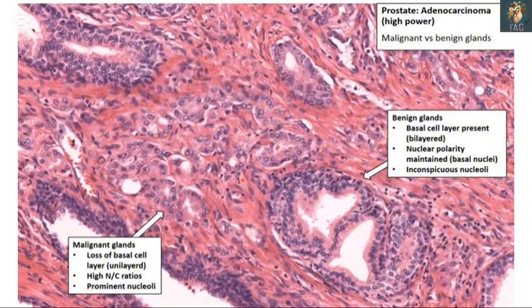But in malignant glands, they are tortuous, the lumen is getting obliterated, and nuclei are hyperchromatic. The diagnosis is prostatic carcinoma. This is detected by raised serum PSA levels, prostatic specific antigen levels. This is your viva question related to this slide. You all must know about it.